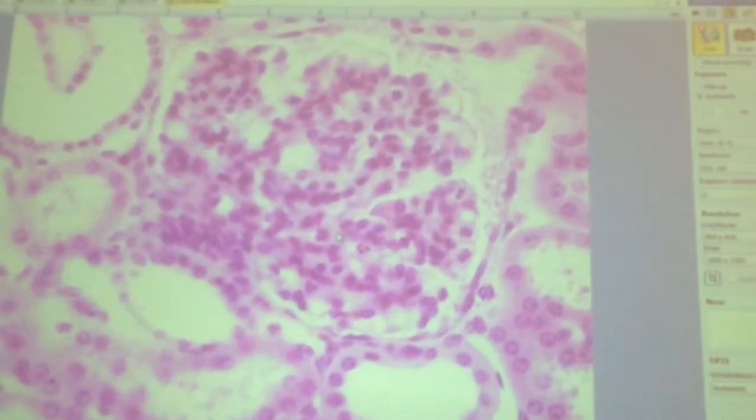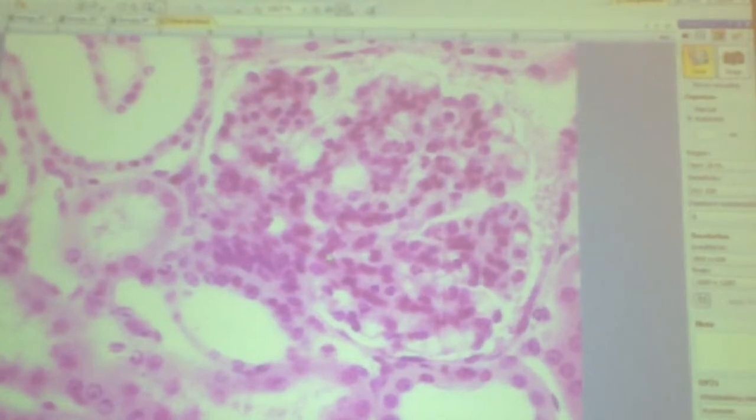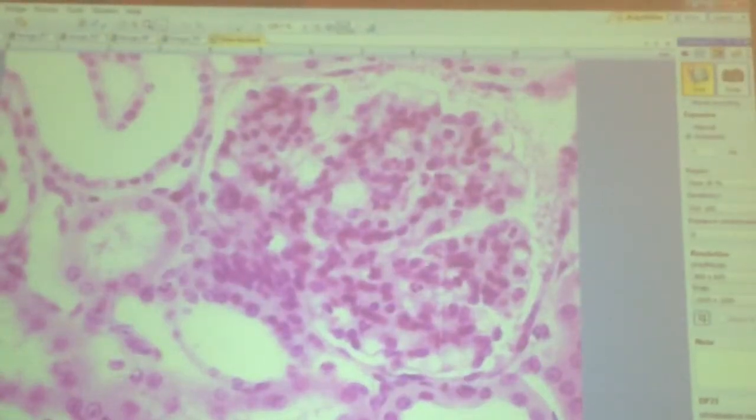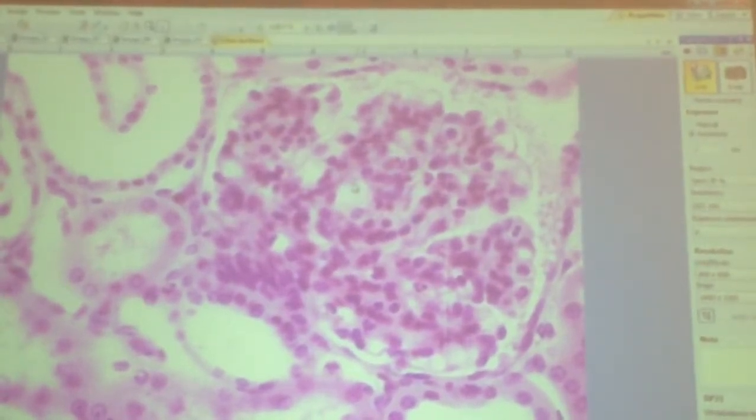Don't go. Okay. Okay. Can you all see okay if I'm pointing with this arrow? My light doesn't stay lit on my pointer long enough to point at anything for a long period of time.